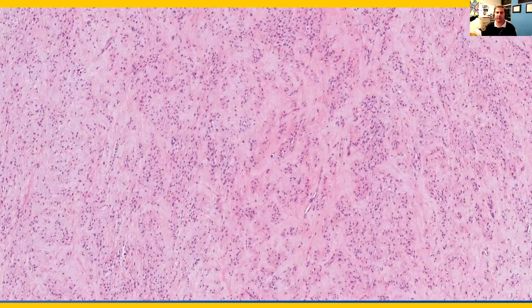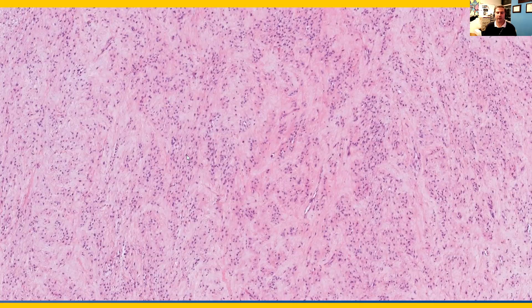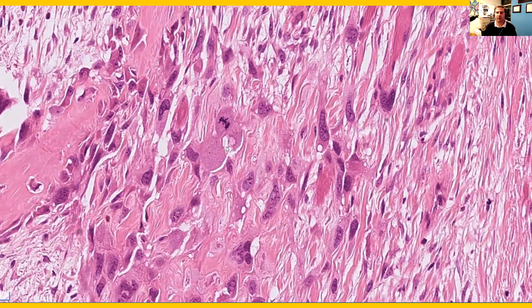At higher power, the fibroblastic component is more evident — these relatively bland spindle cells in a background fibromyxoid stroma. Some areas of this tumor had mitotic activity, which was quite brisk in areas. And there was, of course, ample neoplastic bone formation.